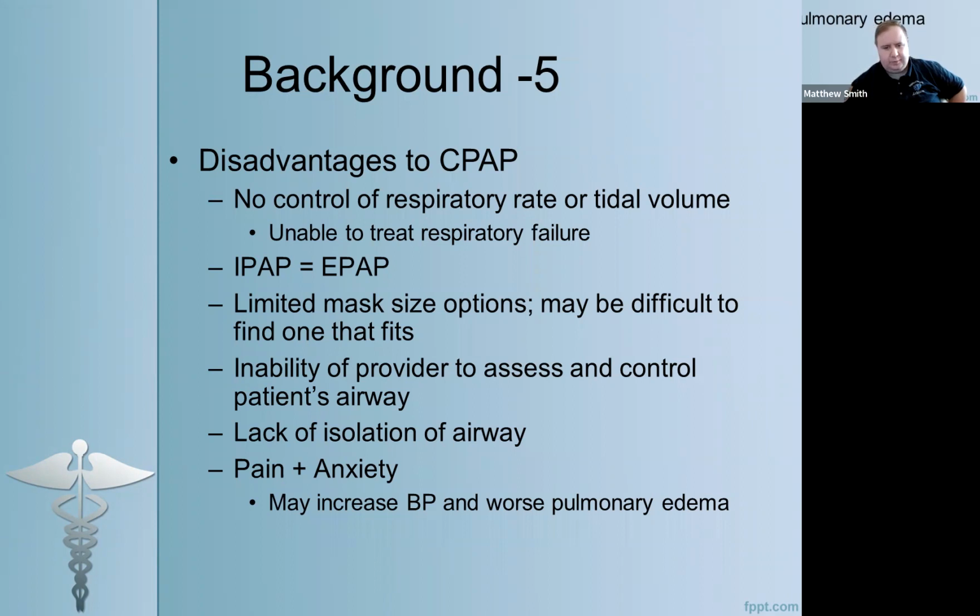So inspiratory positive airway pressure will necessarily equal expiratory positive airway pressure. So this is okay, except if you have a patient that has air trapping taking place. And this is something that we commonly see with our emphysema, chronic bronchitis, COPD patients.